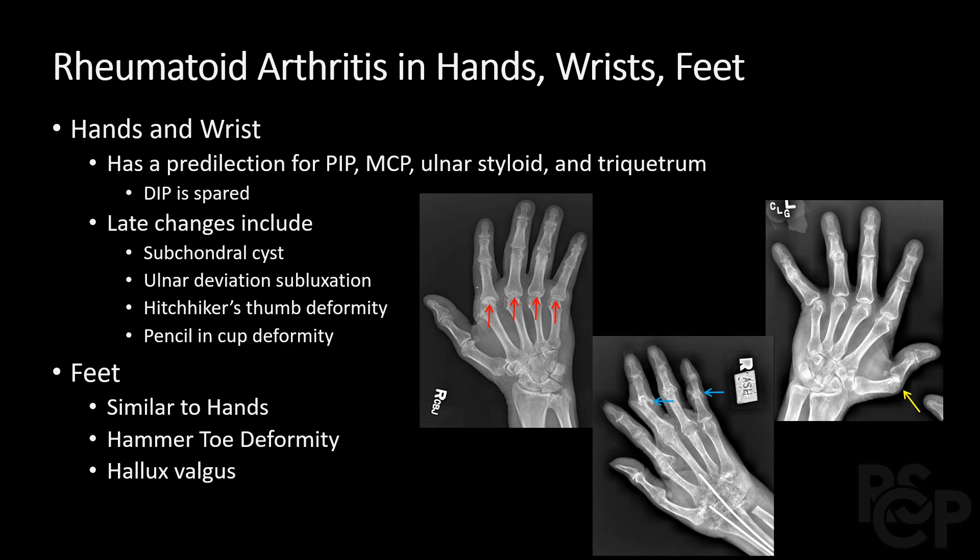Some late changes include subchondral cysts and ulnar deviation subluxation, which we can see here with the red arrows — that's ulnar deviation of the second to fifth MCP joints. We also have the hitchhiker's thumb deformity, seen with the yellow arrow, and the blue arrows represent the pencil and cup deformities involving the third and fifth PIP joints.